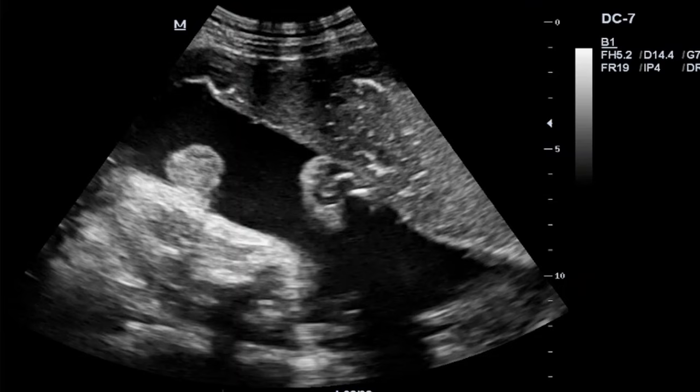If a practitioner is not all that skilled, he or she might actually miss the sex of a fetus. To determine the sex of the fetus, it needs reorienting the patient so that the fetus can have the legs opened and you can better visualize.